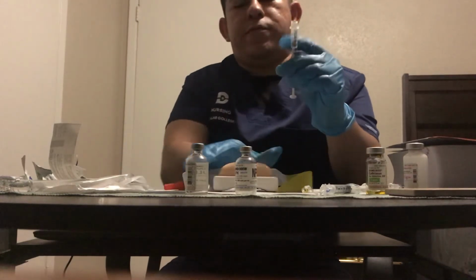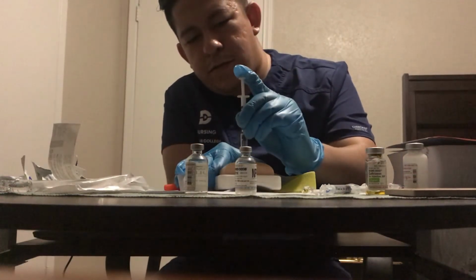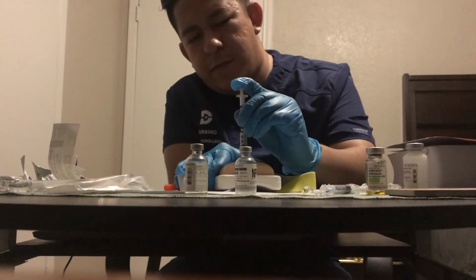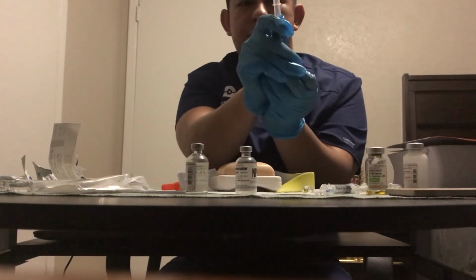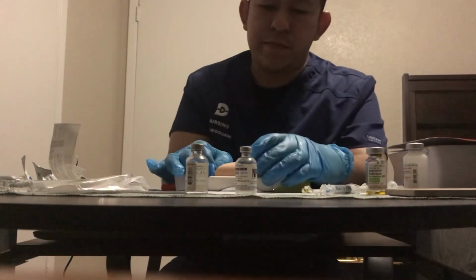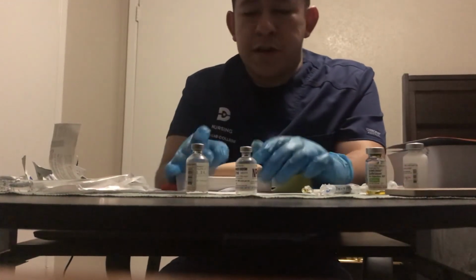Remove the cap, pinch my inch, and just go straight down. Inject, and then take it up and activate the safety immediately. Dispose of it in the sharps container. Make sure after every injection there's no bleeding.